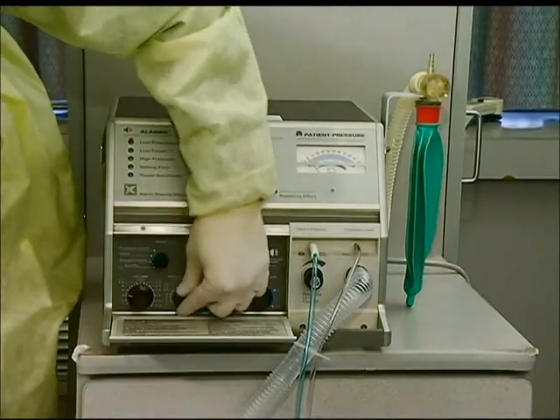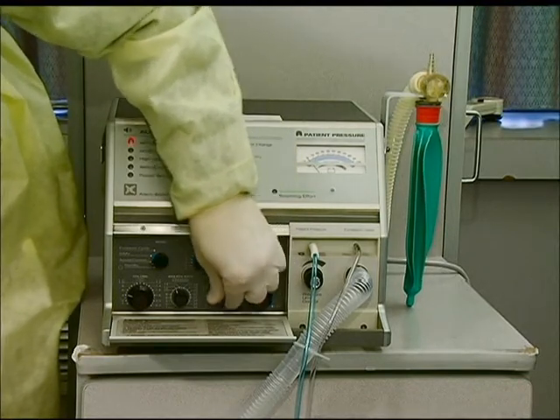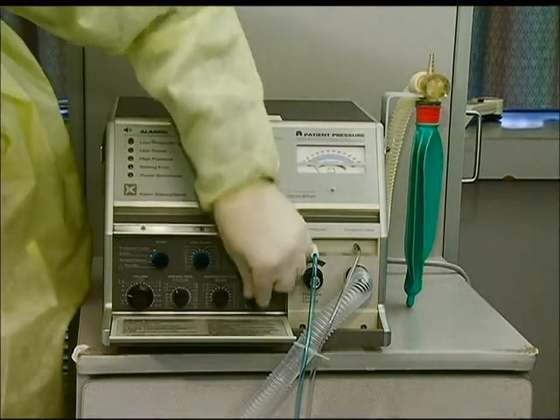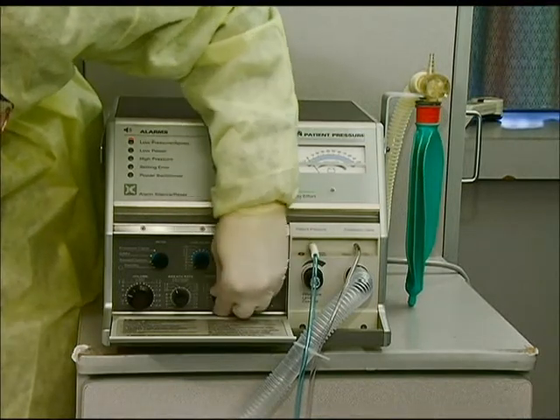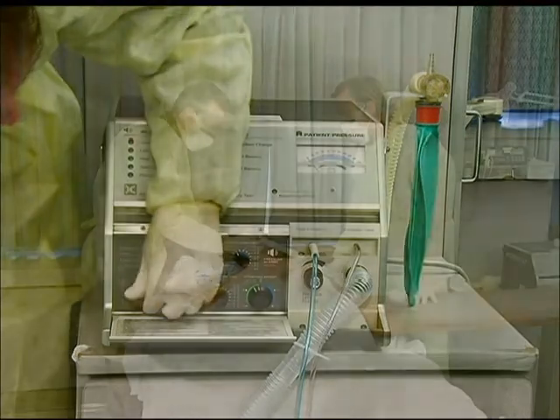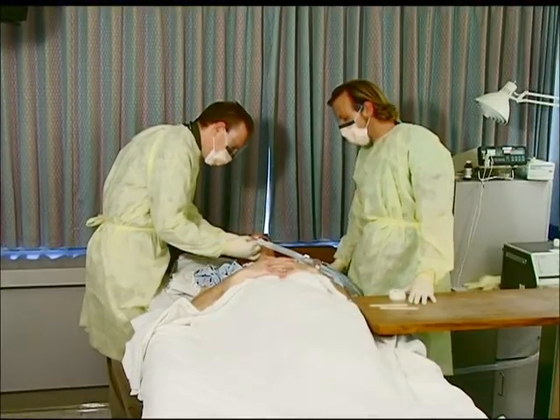Commonly, adjustments to the ventilator will need to be made. To adjust any of the parameters, simply dial the control knob to the prescribed setting. Adjustments to the alarms may be necessary after adjustments are made; follow the same procedure as described earlier. As always, monitoring the patient's response to changes in the ventilator settings is imperative.